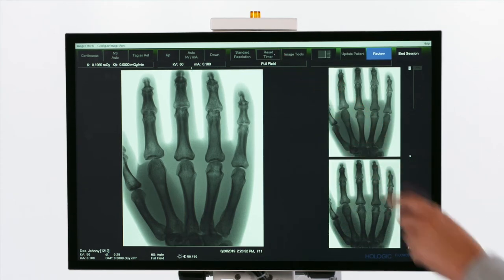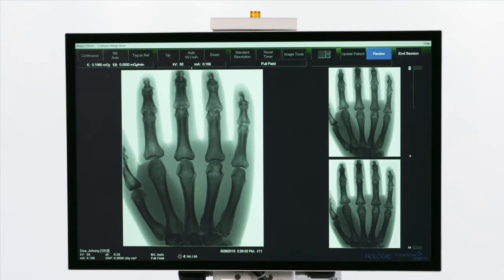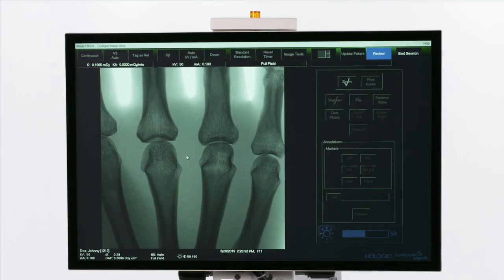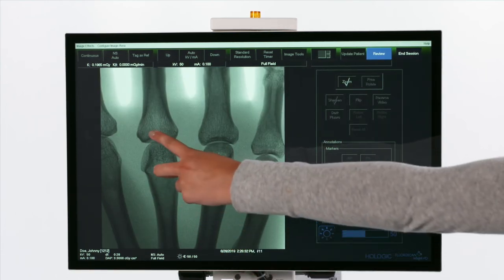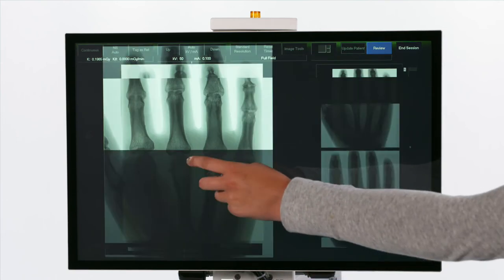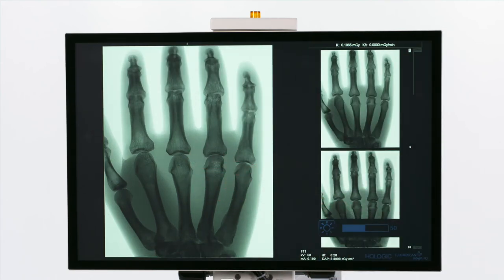The alarm timer will sound after 5 minutes of radiation time. To reset the timer, click the Reset Timer button in the function buttons bar. Pinch to zoom allows the user to magnify the image. Double click on an image to display it in mega view mode, which provides the ability to display a 50% larger image.